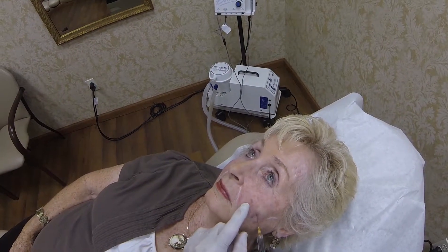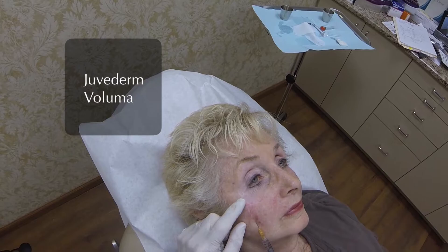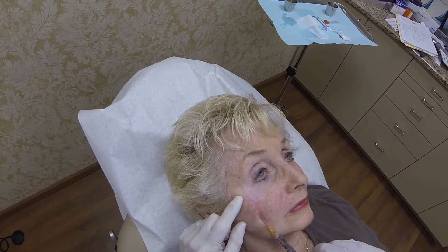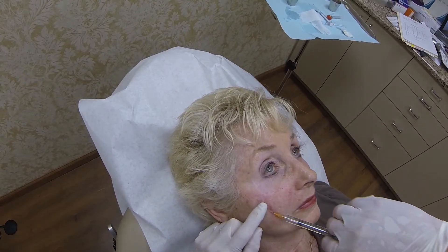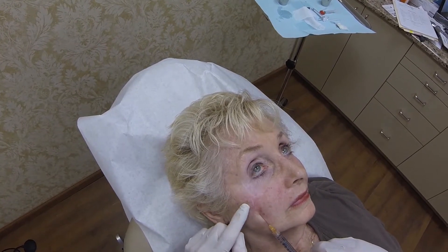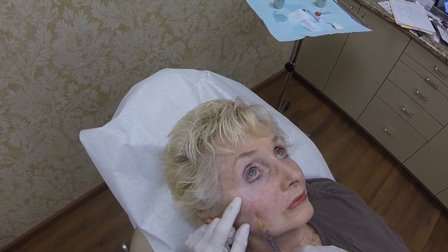This comes premixed in the same hole that we're already there, and we're the only doctors who do this blunt needle technique, which is no pain, no bruising, and it gets just a much more natural result, rather than depositing a lot of the filler in one spot. We are going to massage this, just gently to distribute it a little bit more.